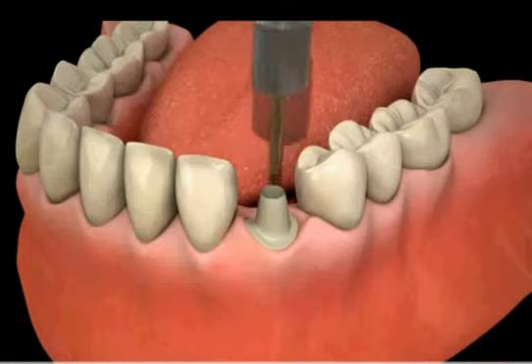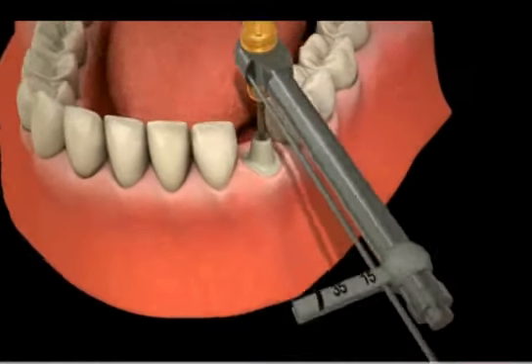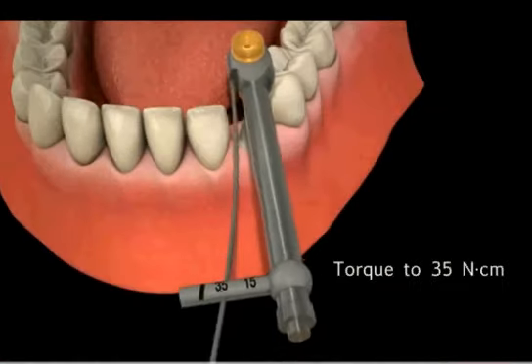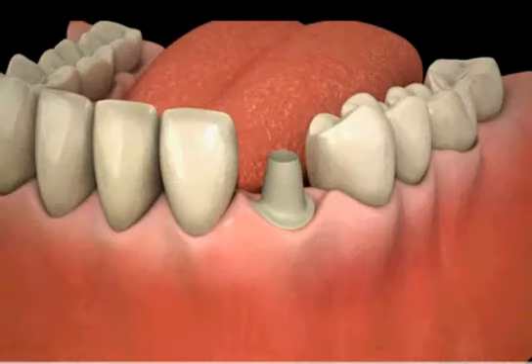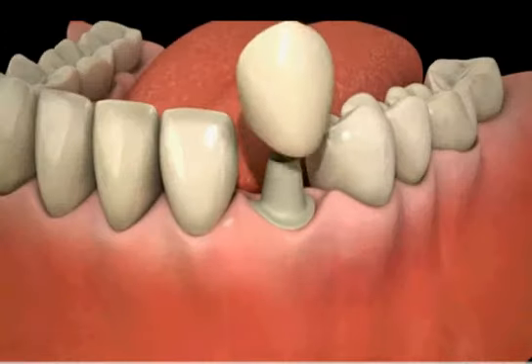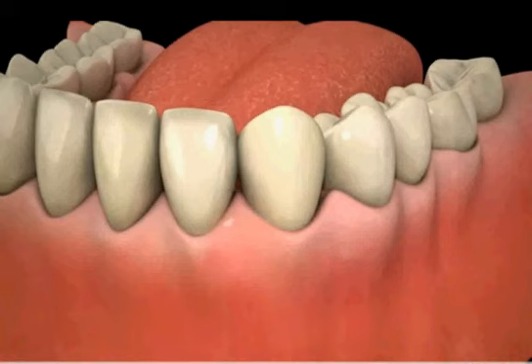The screw holding the post is then tightened to help prevent loosening of the post during biting and chewing. This process is termed torquing. After this tightening process, the post is now ready to receive the crown, which is cemented onto the post.